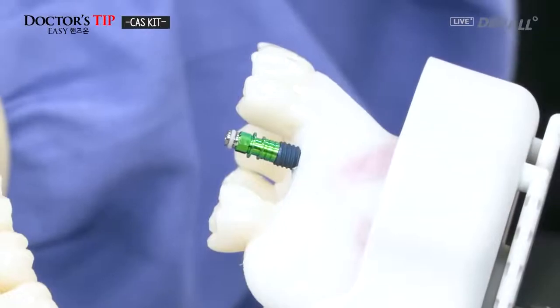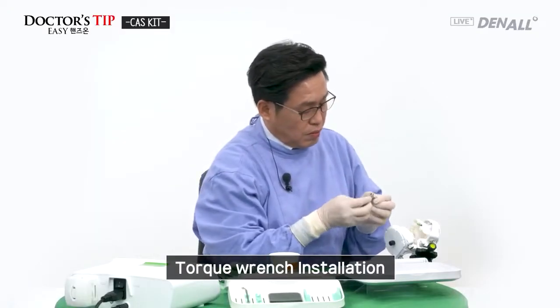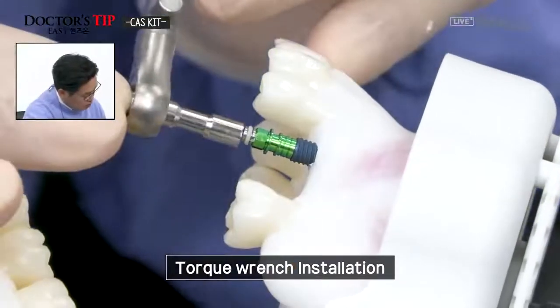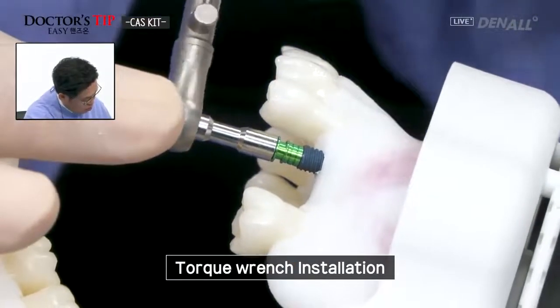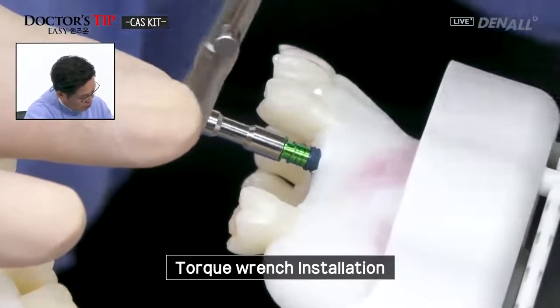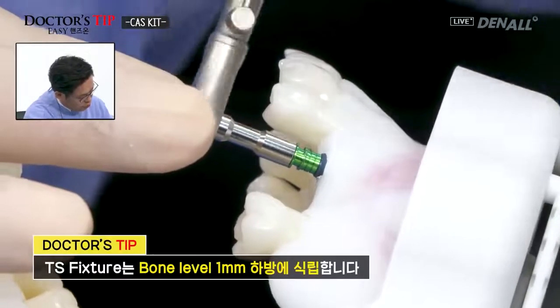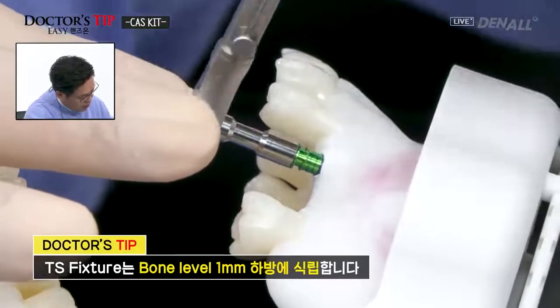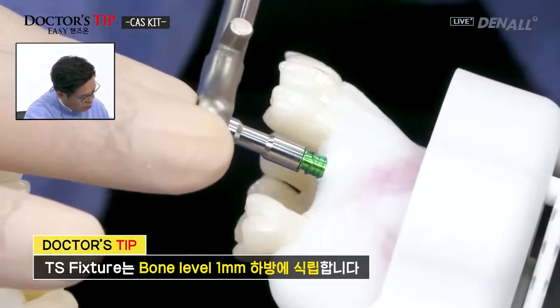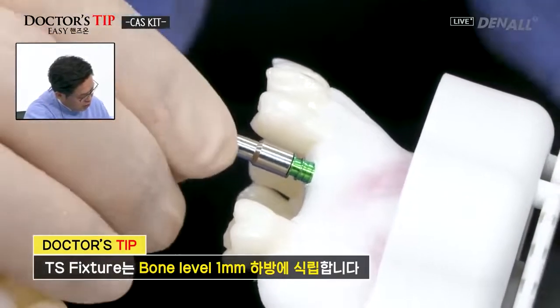So the torque is high. Using the hand wrench, positioning will be done. Using the hand wrench, it is fully seated. 30 Newton centimeters, enough torque has been achieved on the model. This is the TS fixture, and it will be placed up to 1 millimeter below the bottom of the bone level.